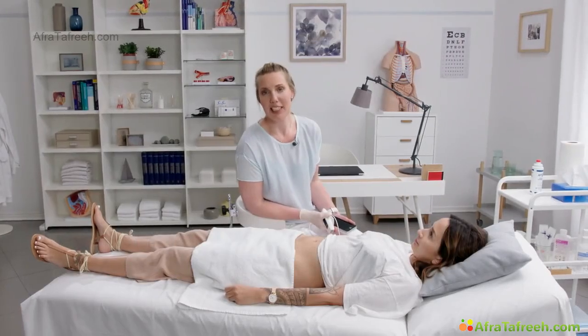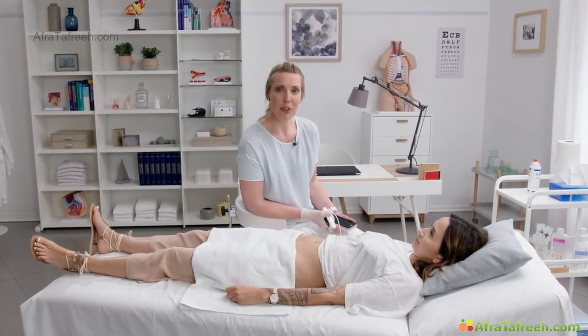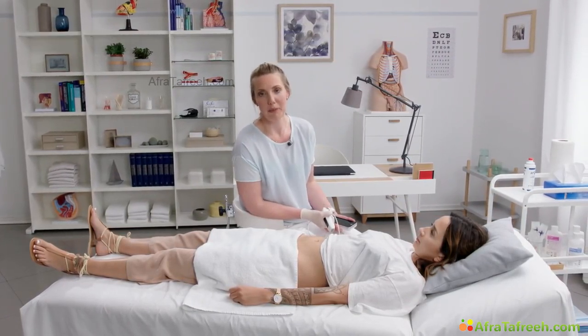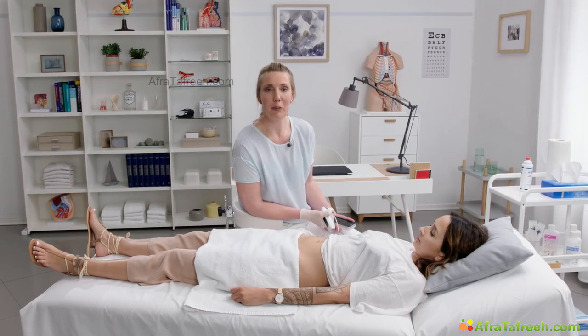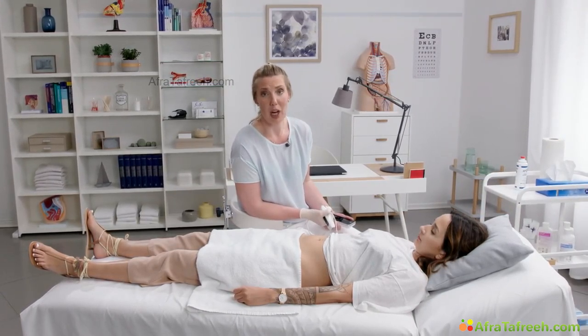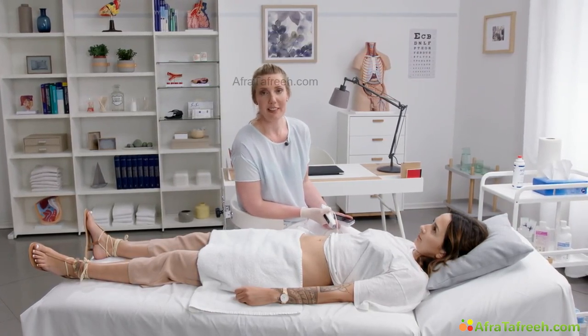I'd like to give you some take-home messages. First of all, always press firmly and use the bladder as a window. A filled bladder preferably, but if it's not filled, then just give the woman something to drink and wait for half an hour and try again.